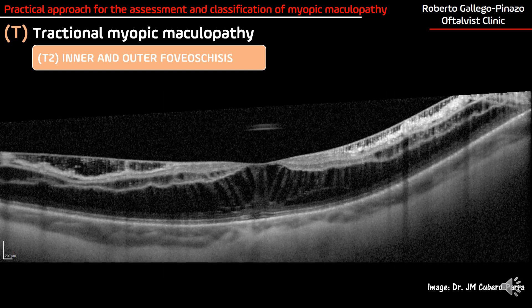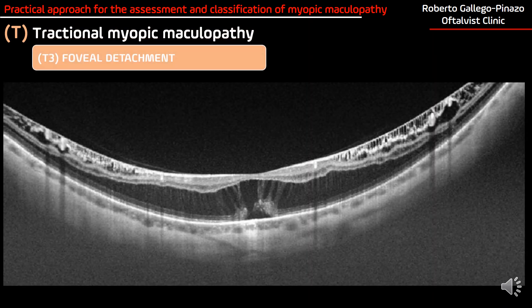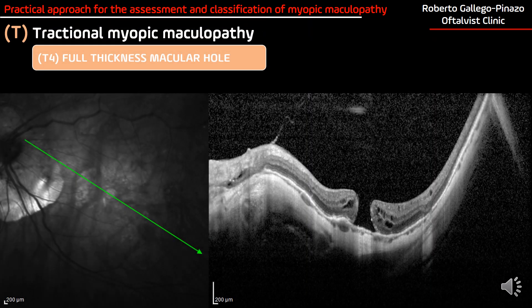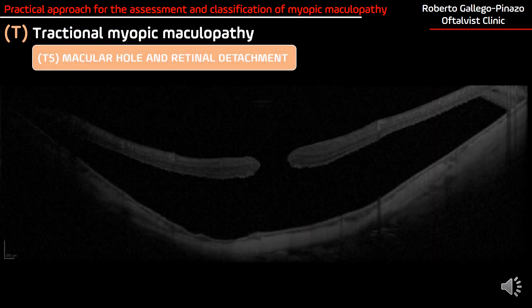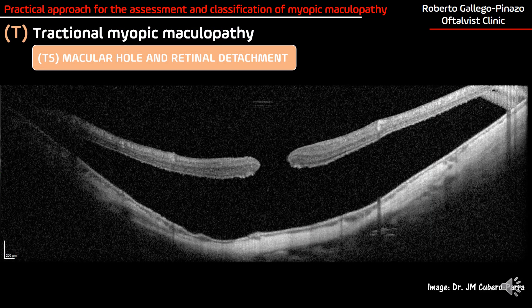This beautiful image provided by Dr. Juan Manuel Cubero from Córdoba, Spain, beautifully illustrates the outer foveal schisis and the inner foveal schisis in one case. Eventually, these cases may develop foveal detachment, and also full-thickness macular holes — with a particular situation in myopic patients where the macular hole may behave as a rhegmatogenous lesion leading to retinal detachment, which is T5 stage of tractional myopic maculopathy.